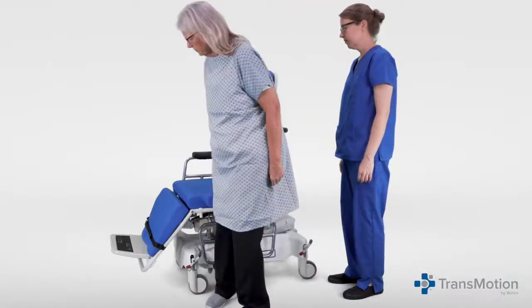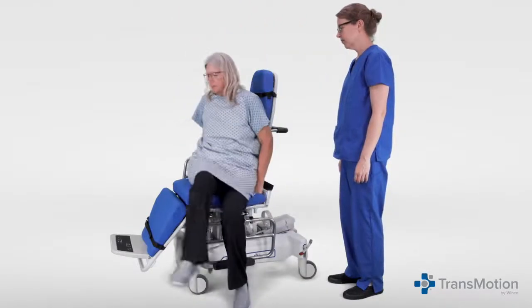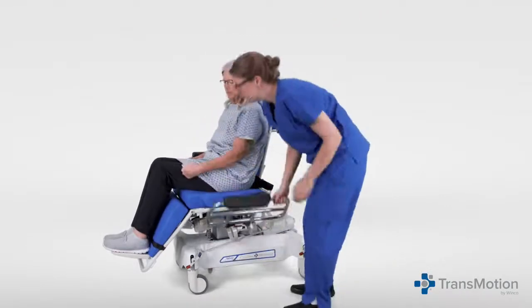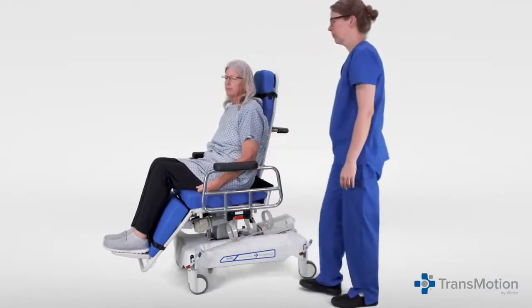For safe patient ingress and egress, ensure the patient enters and exits the chair from the side. Once in the seated position, move the side rail into the lock position.